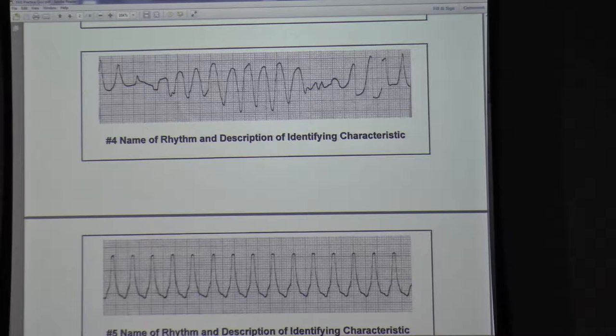The defibrillator, okay, probably will shock this. If the rate is over 150, okay, which is a little hard because it's irregular, it probably will shock it, if it could find something to look at on it, because again, it's grossly irregular. It probably will shock it, and you probably would have a good outcome. It would be the appropriate treatment.